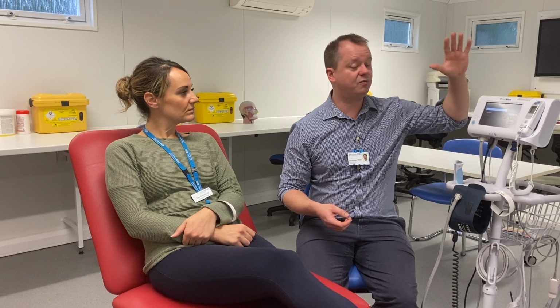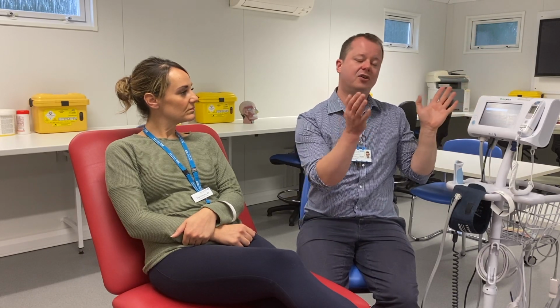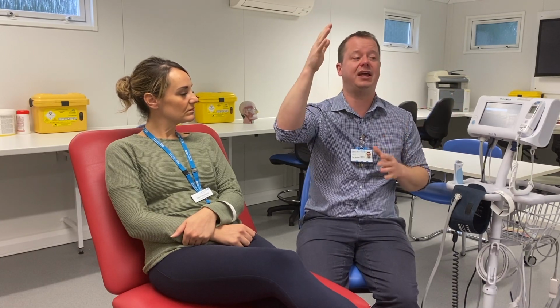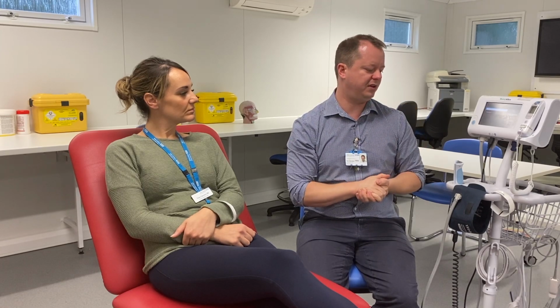These OBS machines we use at West Hospital also connect to our electronic patient record, so when you record the observations on here they get uploaded to the electronic record called eCare straight away, so you can view all the patient's vital signs and they'll put them in an OBS chart for you.